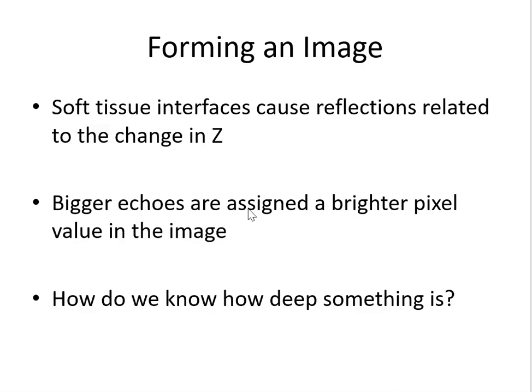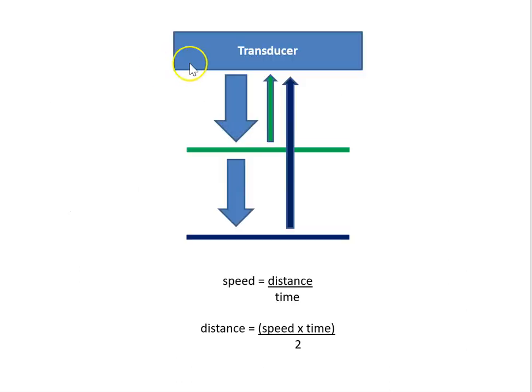But we need to know how deep something is, not just the fact that the sound bounces back. So how do we know how deep something is? Well, we use the speed of sound, and we know how long it was since we fired a sound pulse from the transducer, so therefore we can work out how long it takes for that sound to come back.